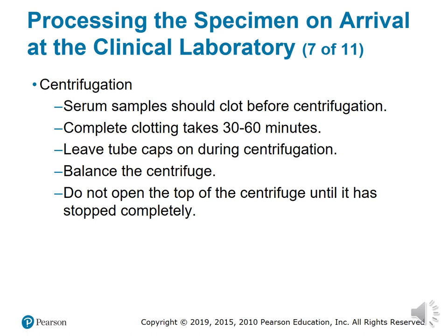You know how you know when your centrifuge isn't working? When you start hearing clink, clink, clink, because all your tops done popped off because the pressure is so high in your centrifuge that it popped all your sample tops. All of them. So now you got a bigger mess to carry and a bigger mess to clean up. So that's how you know when your centrifuge needs to be recalibrated.